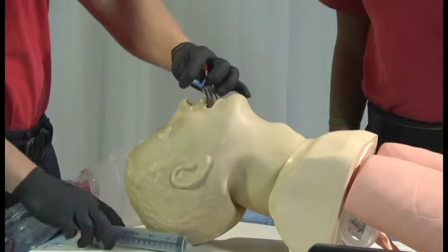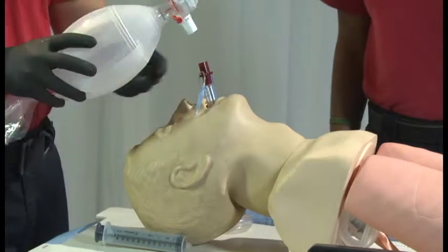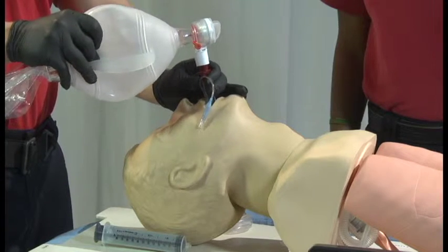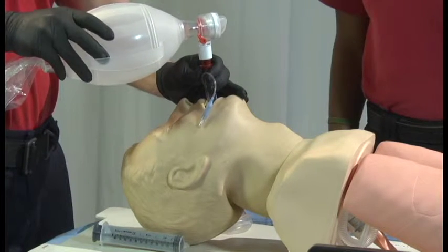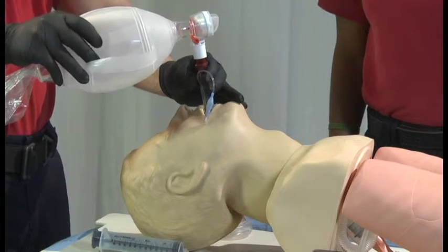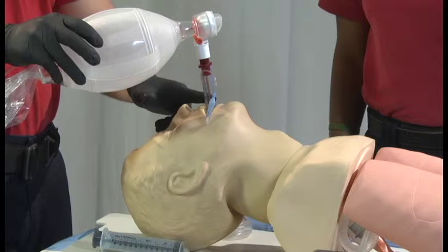Inflate the device to the appropriate volume as listed. Begin ventilation, simultaneously withdrawing the airway until ventilation is easy and free-flowing. This technique is recommended by King Systems, makers of the King LTS-D. Note the depth mark as provided on the device and document.